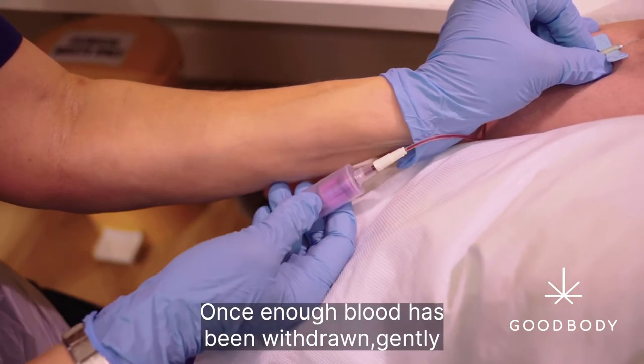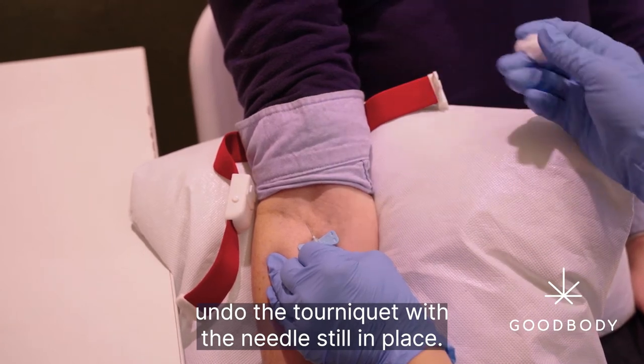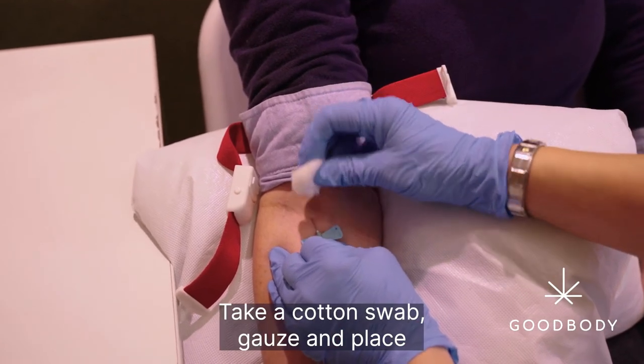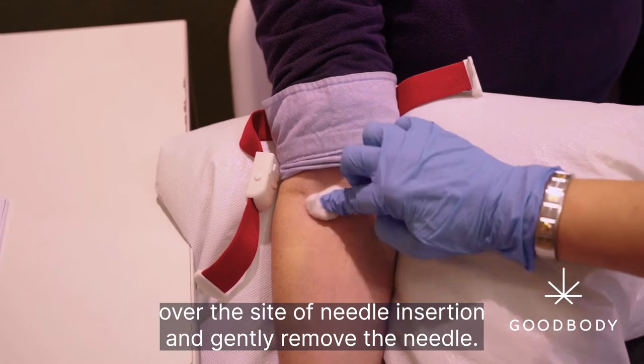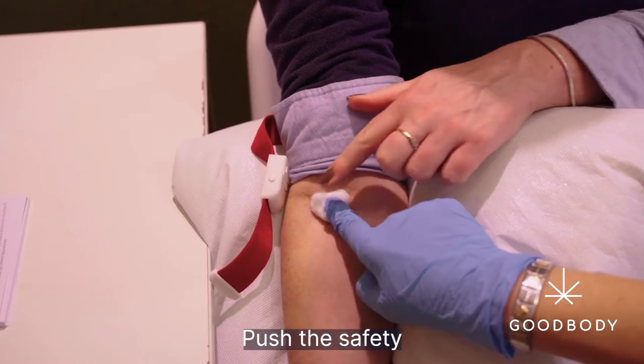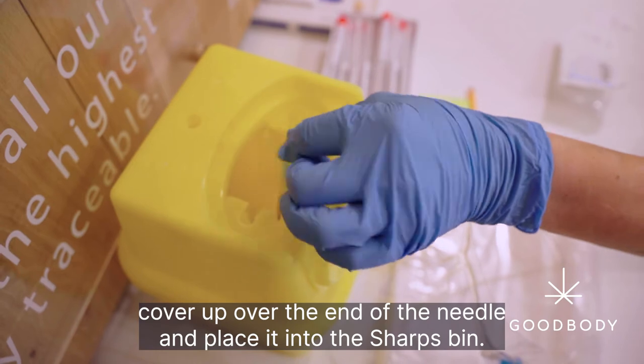Once enough blood has been withdrawn, gently undo the tourniquet with the needle still in place. Take a cotton swab or gauze and place over the site of needle insertion and gently remove the needle. Push the safety cover up over the end of the needle and place it into the sharps bin.